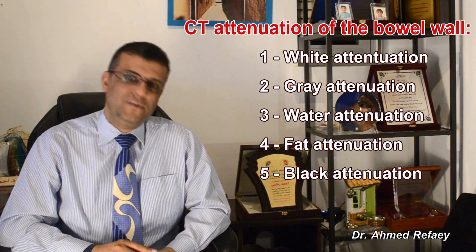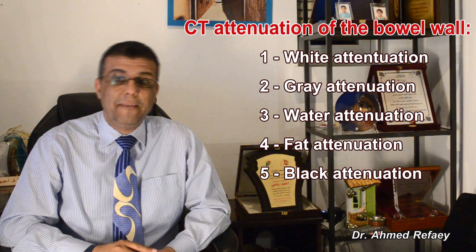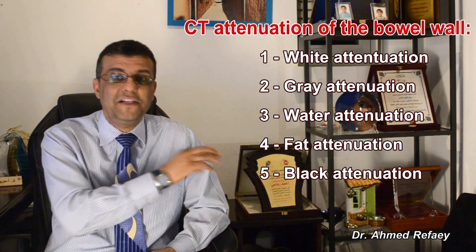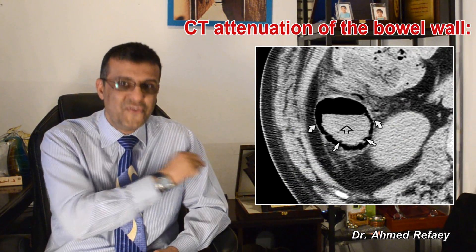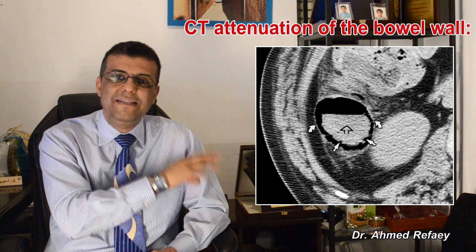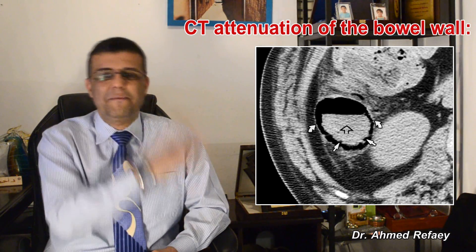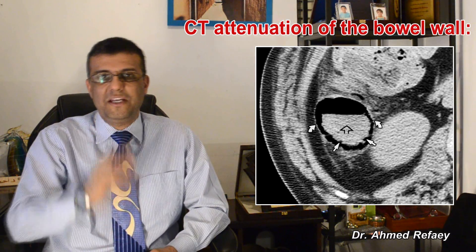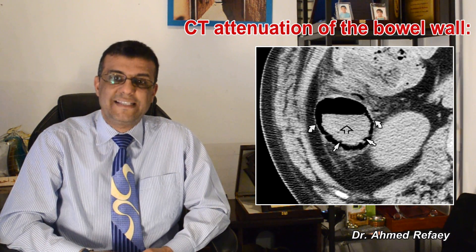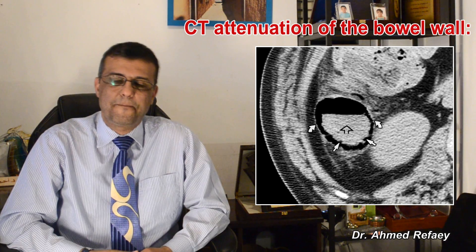The last category is black attenuation, which refers to the presence of intramural gas, as seen in this image. This usually indicates ischemic bowel disease, especially when associated with gas in the portal tracts.